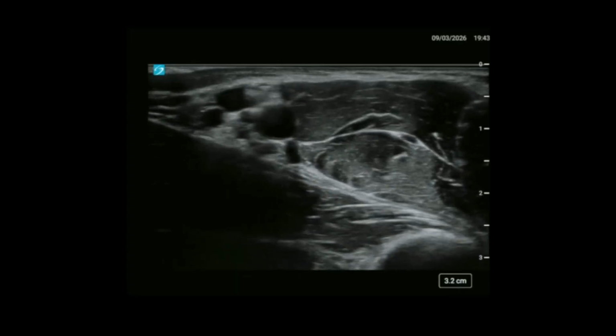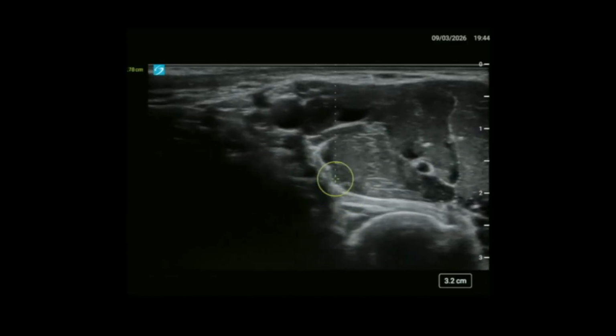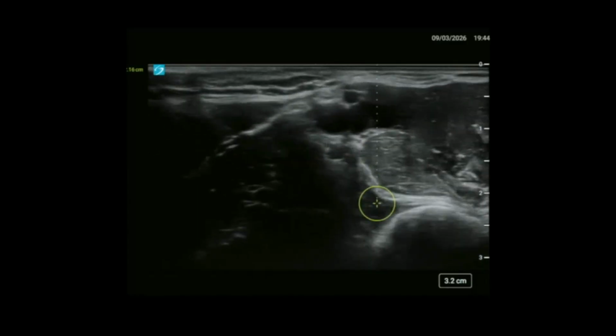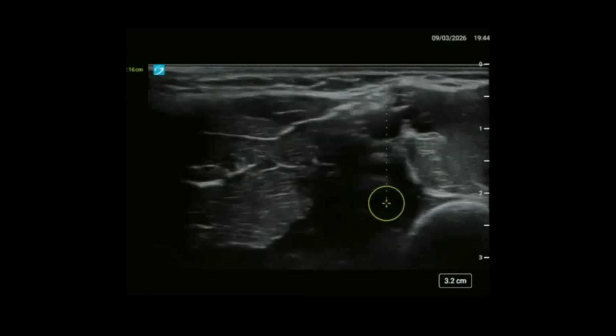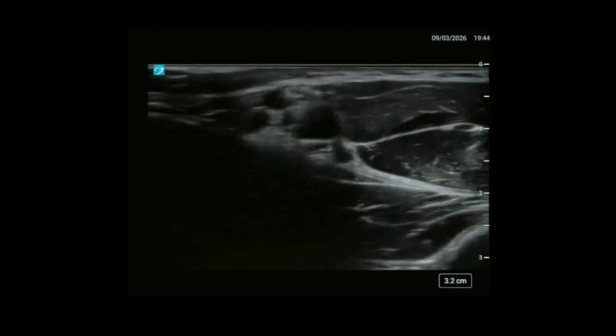And if we move more distally, say just to here, already we can see some structures, which is actually the radial nerve, starting to move down towards the humerus. So we risk missing those if we don't block them at the right level.